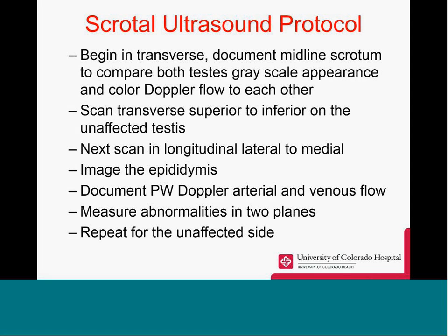After you've evaluated the testicle, you want to image the epididymis as well, documenting the head, body, and tail. You also want to compare the epididymal color Doppler flow to the testis to determine whether it's hyperemic.